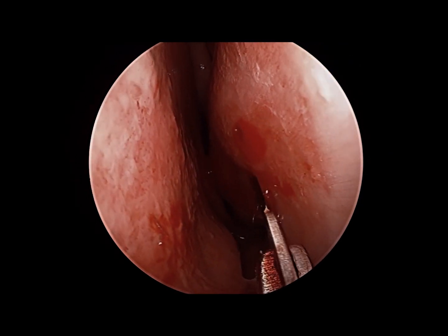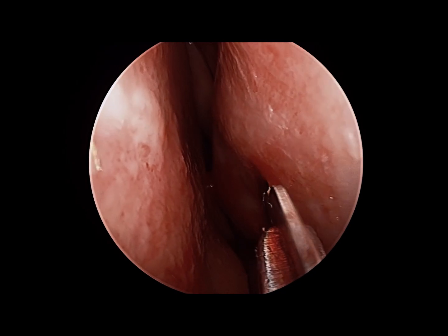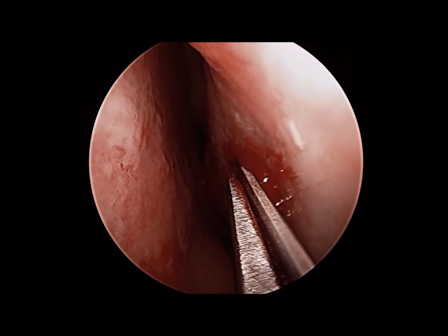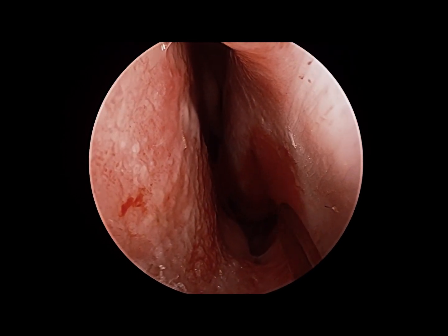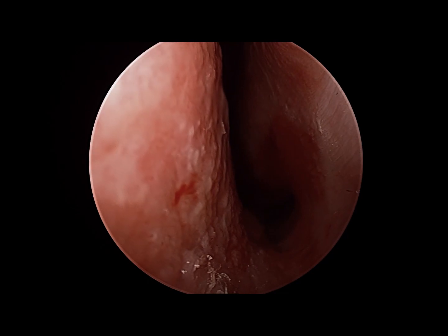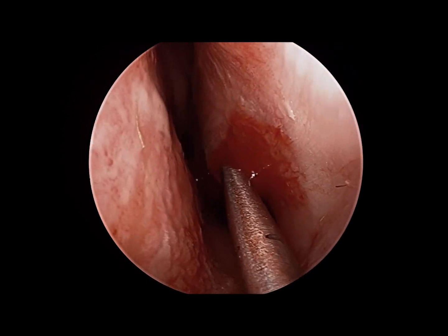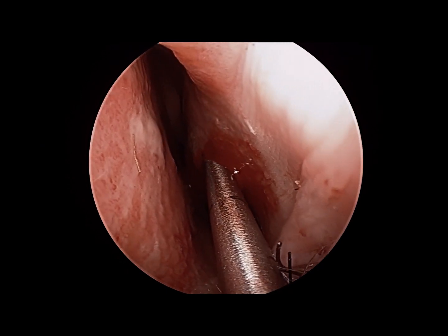The microdebrider tip we use does have a sharp edge, so theoretically you can pass it through the mucosa directly, but I find it easier to use a 15 blade to first make a piercing cut through the mucosa and then create a pocket with the sharp end of a Cottle elevator. Through this pocket I can more easily pass the microdebrider tip.